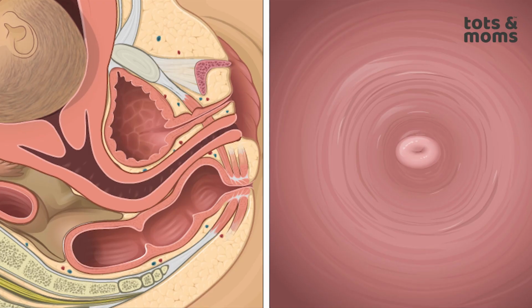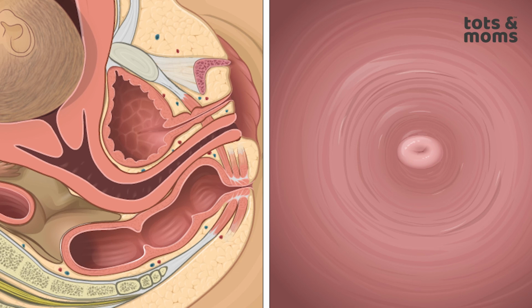Let's talk about the time and process of insertion. Right after your menstrual cycle, you can get it inserted. Please talk to your doctor prior, because some of them say during the menstrual cycle is good because your cervix is dilated. It is a 5-minute process using an insertion rod. The doctor will insert this 1.5 inch device, which can be done in an OPD. You don't even have to get admitted, but please ensure that you talk to your doctor and understand if it is suitable.